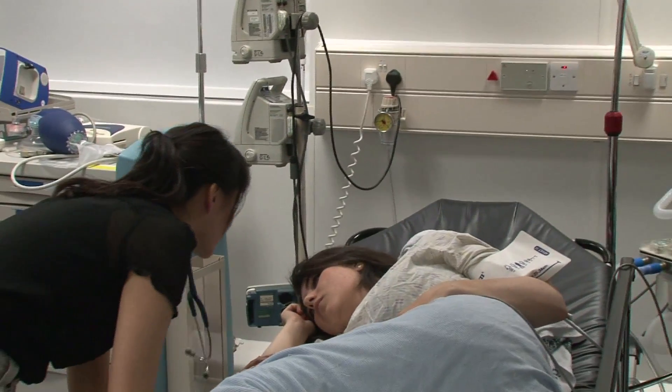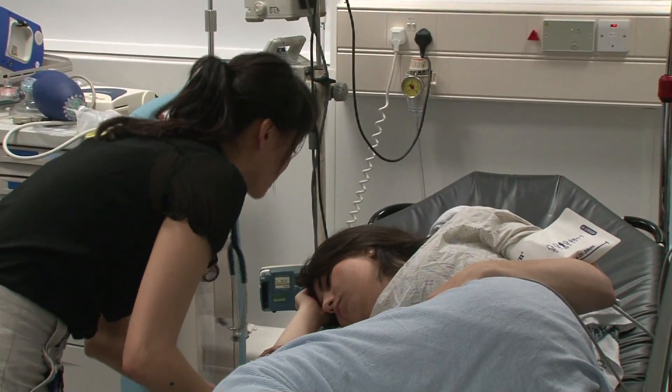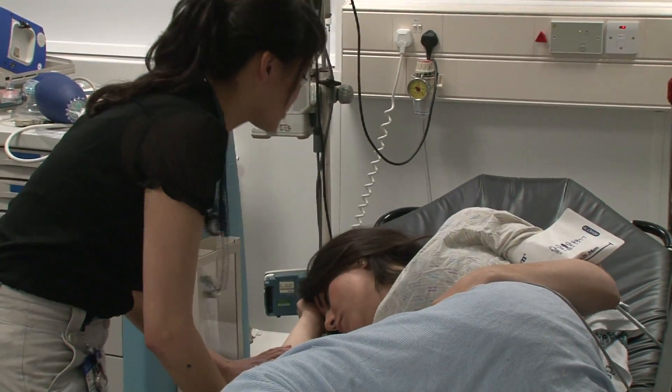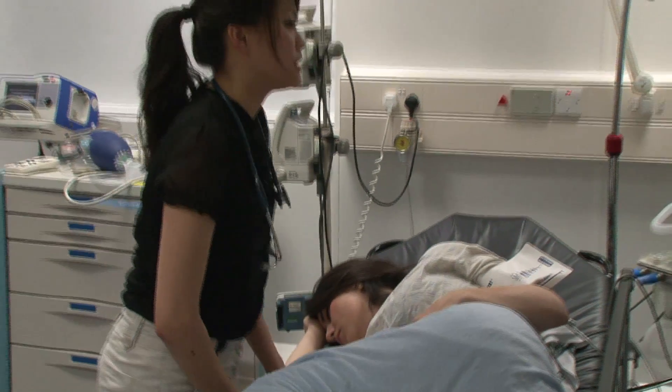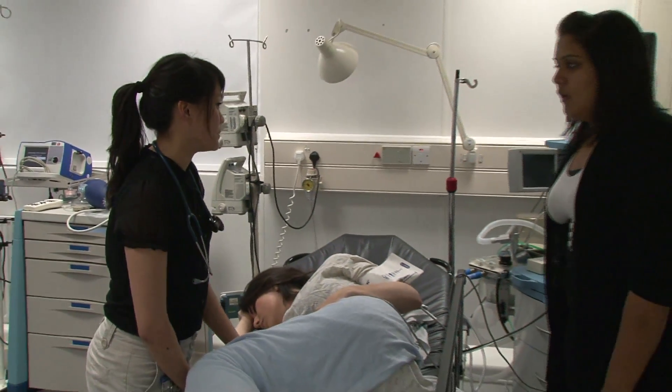Ivy, you've just been a bit sick, okay? But don't worry, we're just going to get some help. Deepa, I'm quite worried about her. Can you call the PERP team?